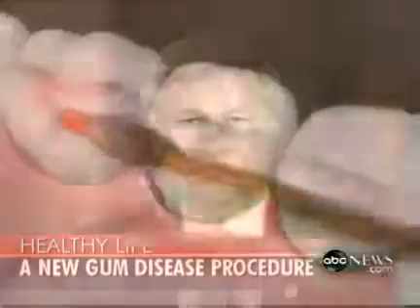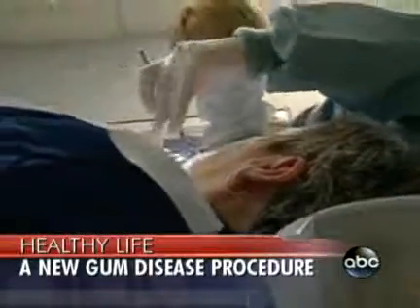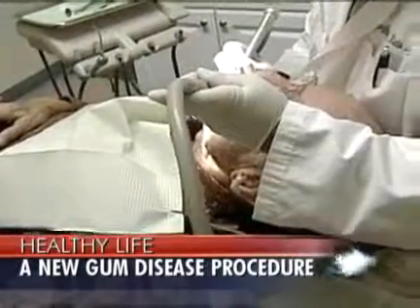Two-hour visits. So what would be the alternative? It sounds like a lot of people today are already going through cutting scalpels and stitches. What does that entail? So how much more of a benefit and improvement will this be? Conventional surgery involves removing tissue in order to reduce the pocket depth. What this procedure is, is a bone building procedure without removing any of the gum tissue or using any scalpels or stitches, just using the laser and the ultrasonics. So it sounds like recovery time is shorter, people can get back to work sooner. Absolutely. Less pain, less bleeding, less infection, less post-op recovery time, quicker return to work, and actually less expensive based on the fact that you don't have to spend so much time in the dental chair.